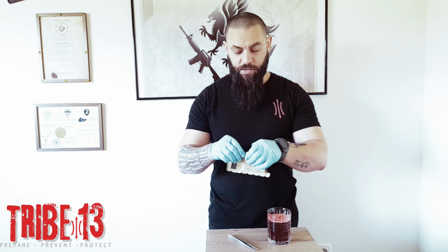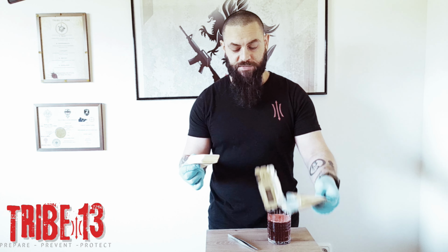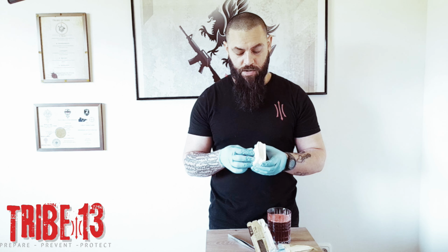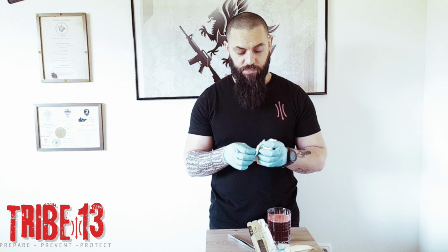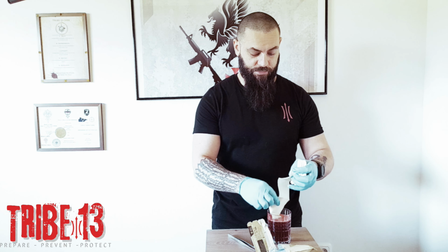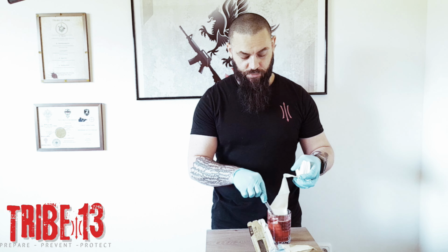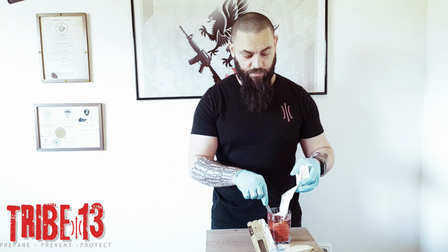So I'm opening the hemostatic gauze. I am taking it outside, and now I begin to insert it in the glass. Easy. So we will see what is happening.